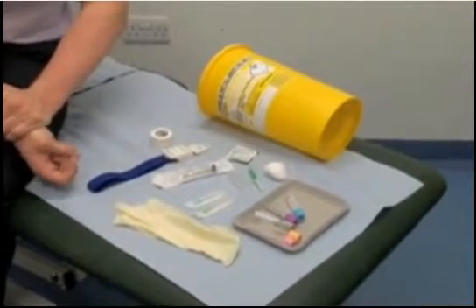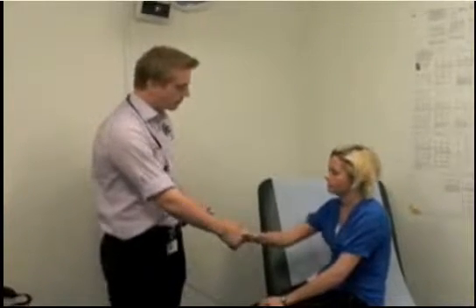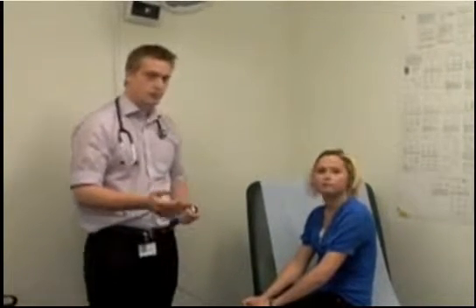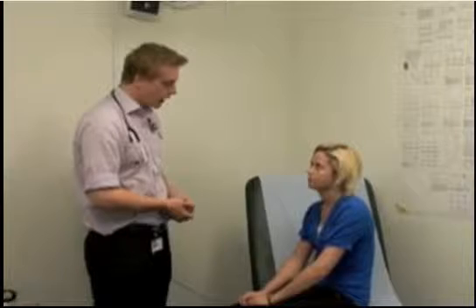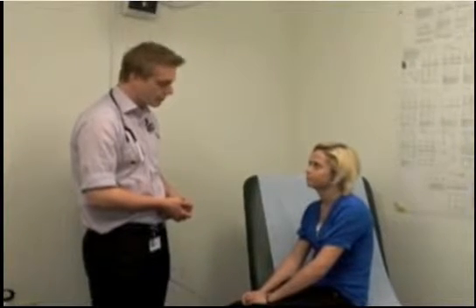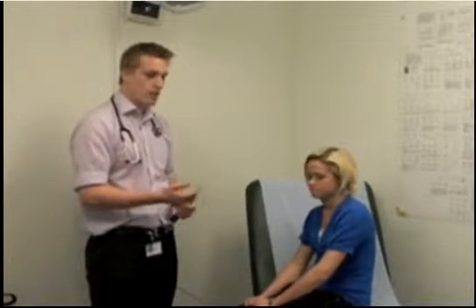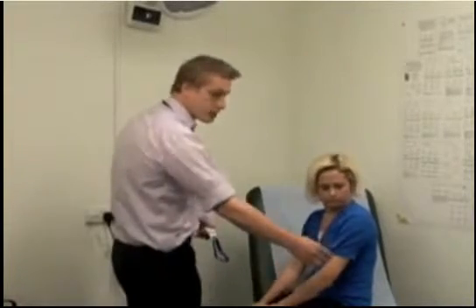After gathering your equipment, you need to confirm you have the correct patient. Introduce yourself: 'Hello, my name is Rhys and I'm one of the doctors here — I've come to get a blood sample from you, is that okay?' Verbal consent for taking blood is sufficient. Then ask for their full name to get two patient-identifiable pieces of information, confirming you have the right patient and that they consent.